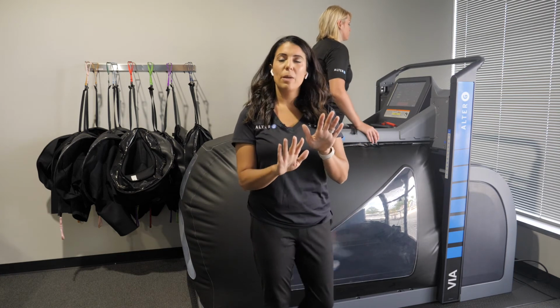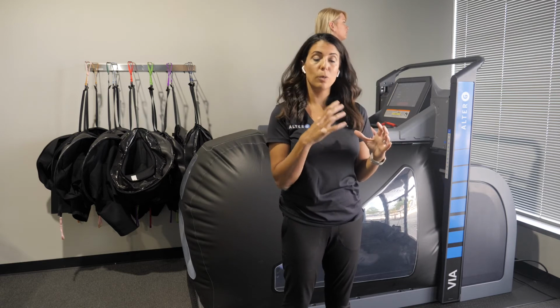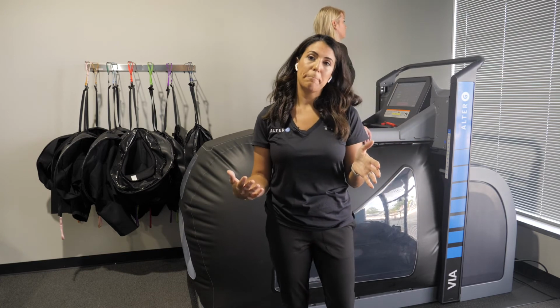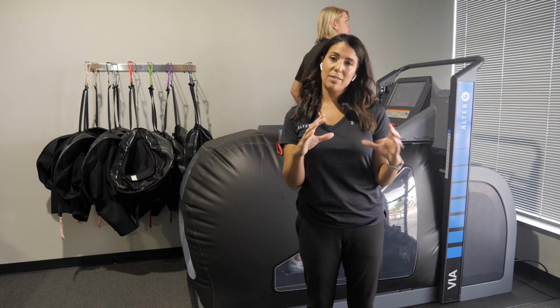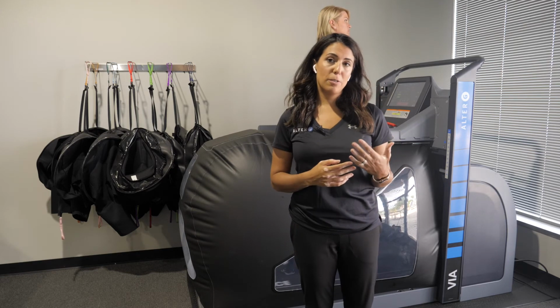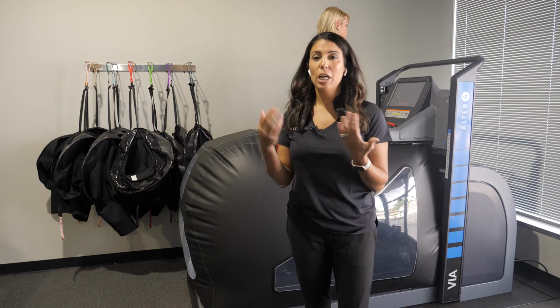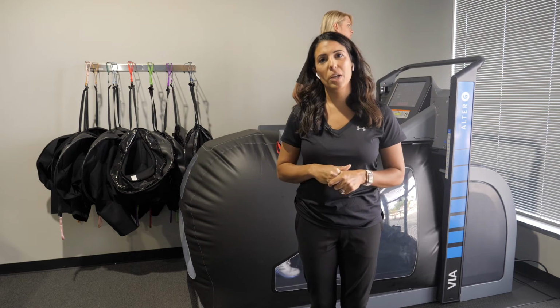So when I get the parameters to a point where I really like their walking and their symmetry looks the closest to normal, I can have them practice at those set of parameters, and I can replicate those parameters next time. If she came back to the clinic 2 visits from now and she was able to achieve that same symmetrical gait at a lower amount of body weight support or at a faster speed, I can also now show direct improvement. I can actually make a case to justify maybe why she's not ready to go back on the field or ready to start walking or doing training over ground.